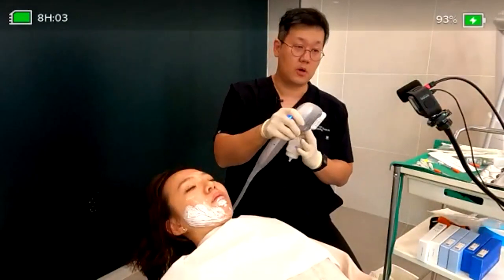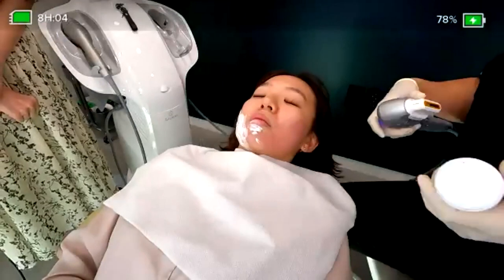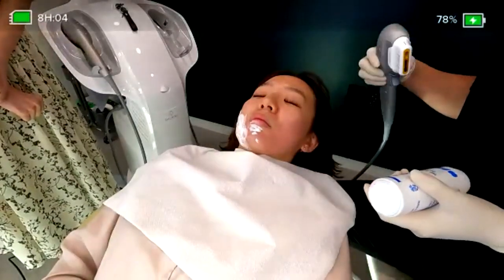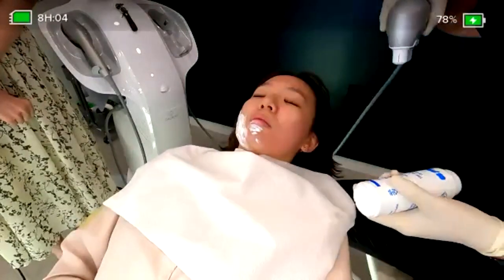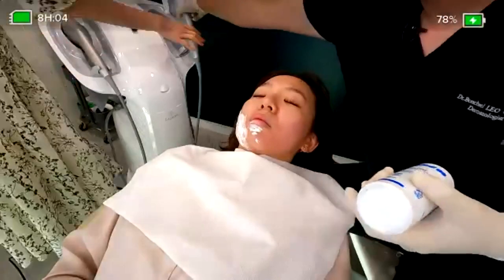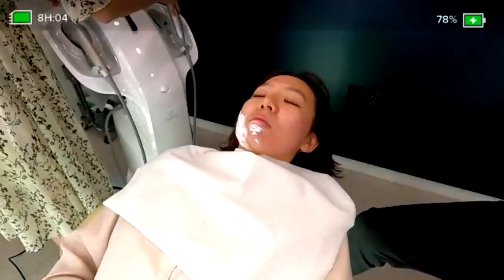Firstly, this one is a 3 millimeter handpiece, a similar tip, and we will go through this way. Before we go through the whole session, we are going to do some of the designs.